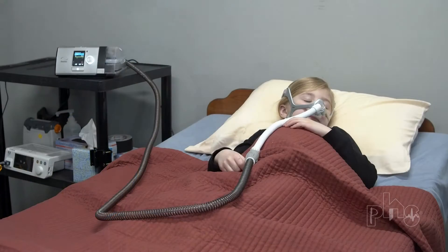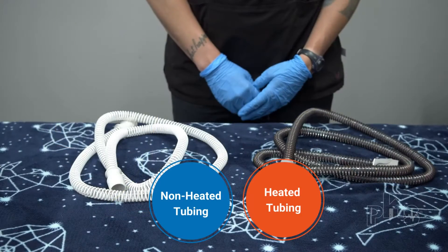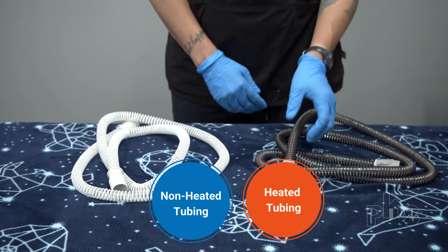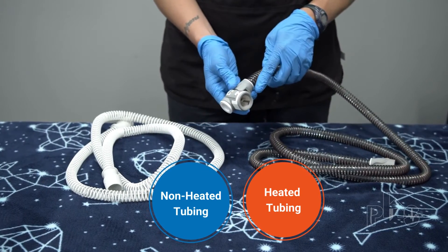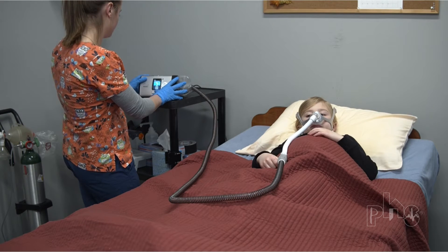Air from the machine goes through tubing on its way to the patient. Tubing can be either heated or non-heated. Heated tubing keeps air warm as it travels and reduces condensation in the tubing. The temperature of the tubing can be adjusted on the machine.